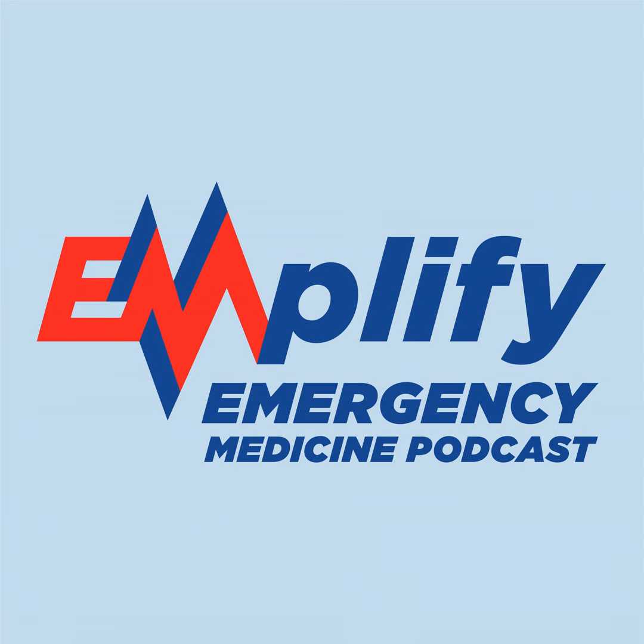And so the I to E ratio is mostly going to be driven by your respiratory rate and somewhat driven by your inspiratory time. If you're using another volume assist control mode where you set a flow rate, there will be a very small dependence on the tidal volume, but in general, the main determinant of your I:E ratio will be your set respiratory rate.